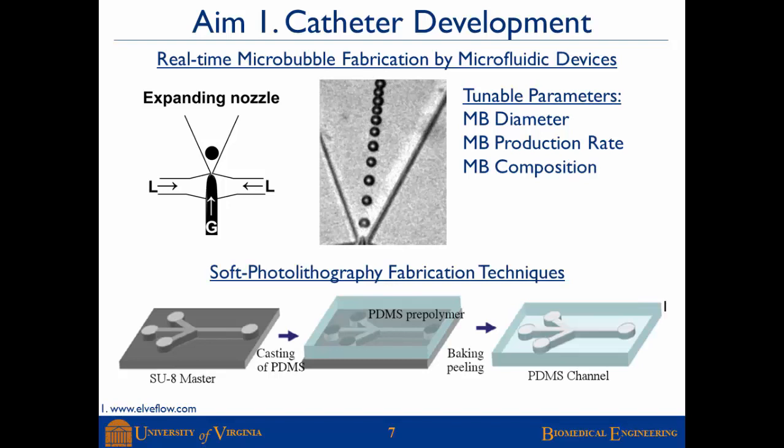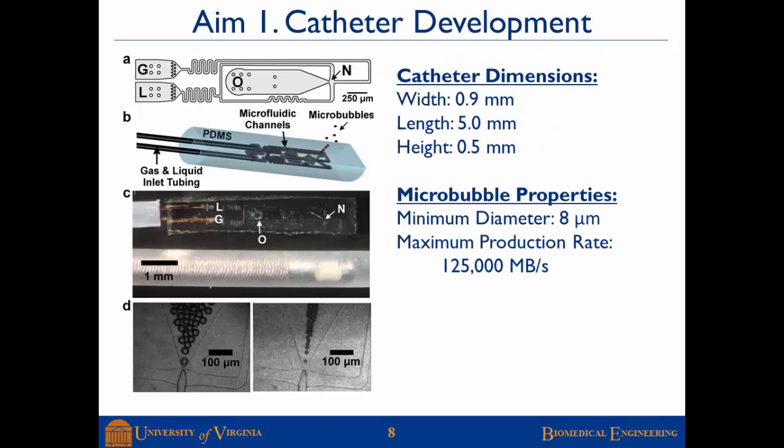We use standard soft photolithography fabrication techniques to fabricate this catheter. The microfluidic channel network has a gas inlet, a liquid inlet, and the two phases meet at a nozzle where microbubbles are produced, with an outlet to release them. Figure C shows a camera photo of the catheter placed next to a Volcano IVUS, demonstrating that it can be made to human-sized dimensions.